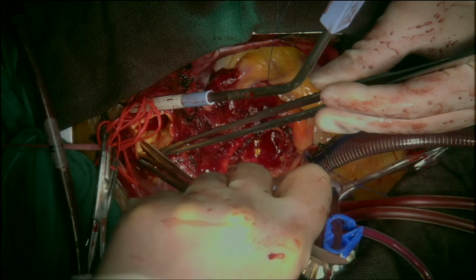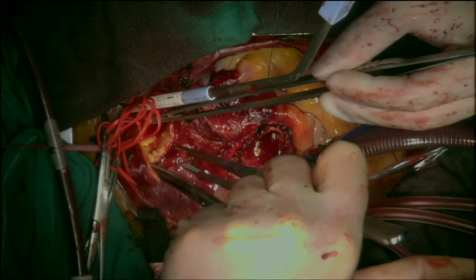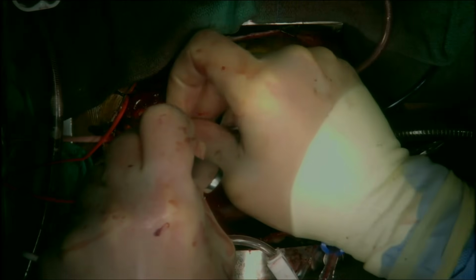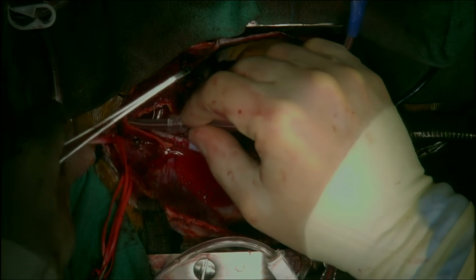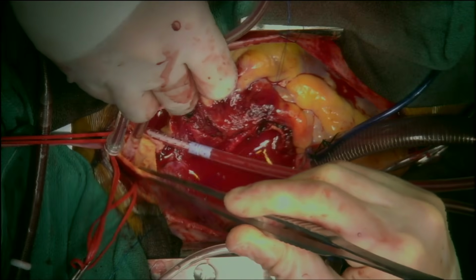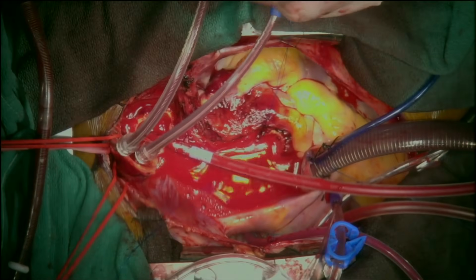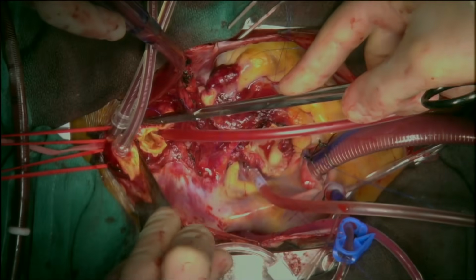The innominate and left common carotid arteries were cut as an island. Balloon inflatable retrograde cardioplegia catheters were inserted into the left common carotid and innominate arteries. The balloons were inflated and the vessel loops were snared. Bilateral selective antegrade cerebral perfusion was initiated and maintained at 10 mL per kg per minute.